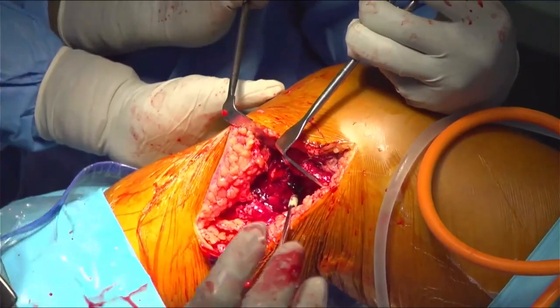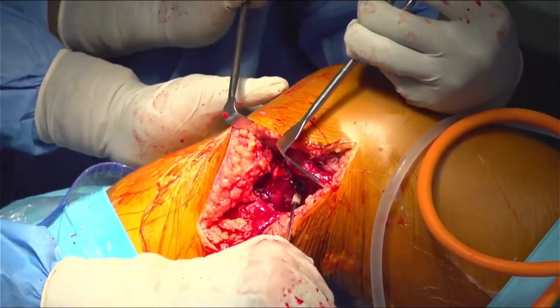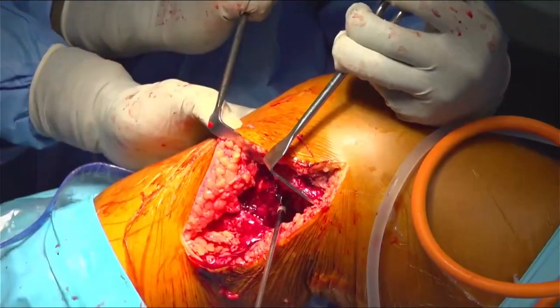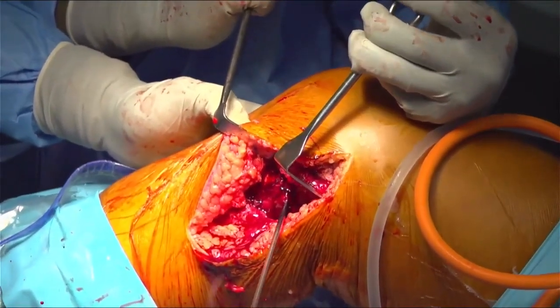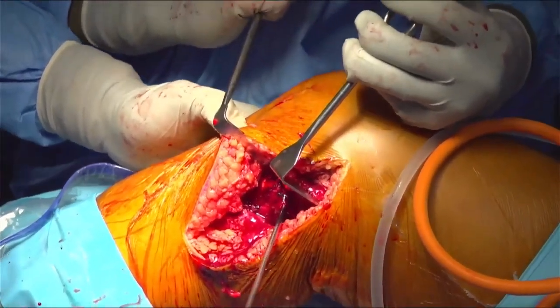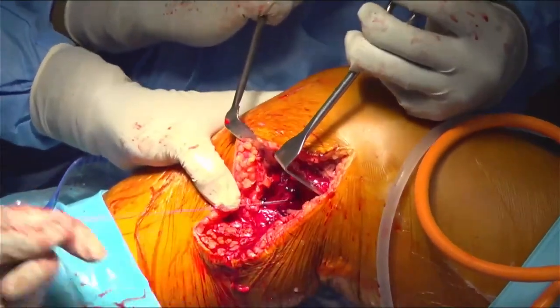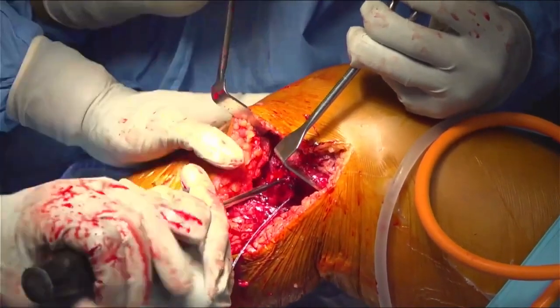Hammer please. Second anchor. The second anchor is a little bit more anterior to it.